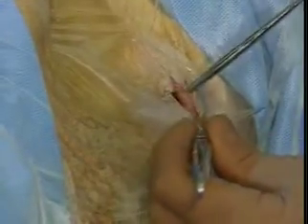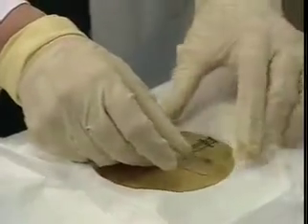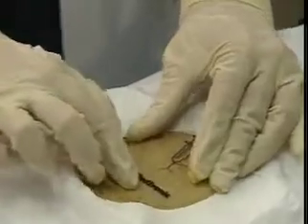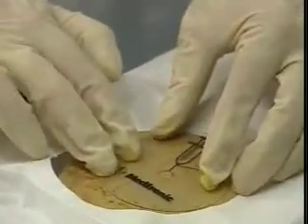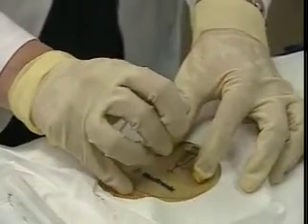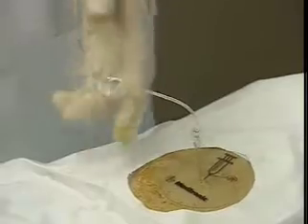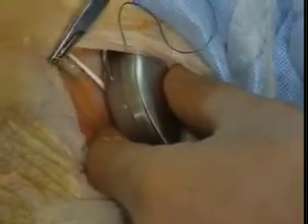from puncturing it. Catheter punctures can also be prevented during pump refill and catheter access port procedures by using the templates provided in the appropriate Medtronic kit. The templates help locate the correct septum, reducing the chance that a needle will miss the septum and damage the catheter. Always coil excess catheter behind the pump and anchor the pump securely in the pocket.